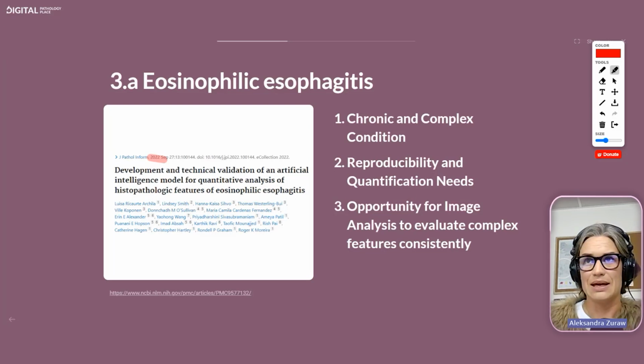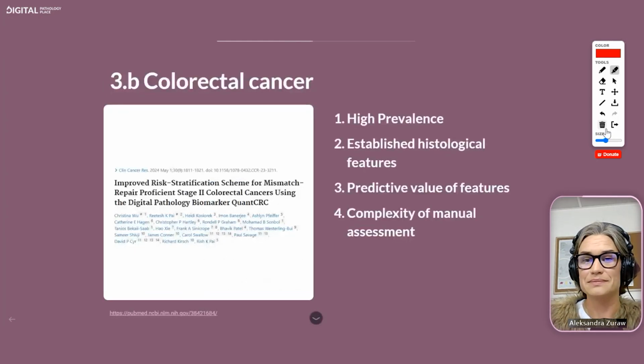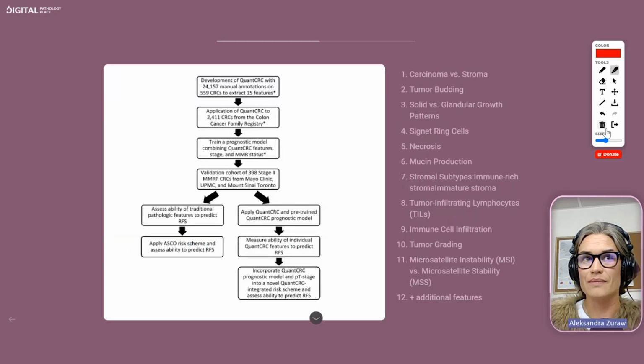Thank you. That's one study. There was a follow-on study in Modern Pathology in which they used the eosinophilic esophagitis histology scoring system very effectively. They got very good inter-rater agreement for most of the features in that scoring system. I think the major breakthrough for that particular disease, or any disease involving a lot of eosinophils, is the ability to count eosinophils.